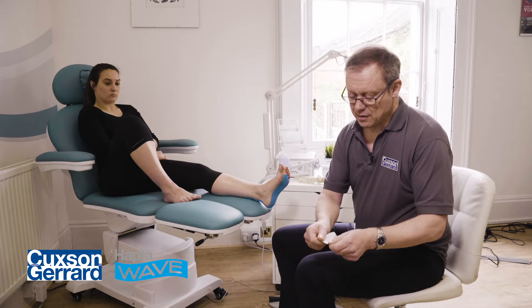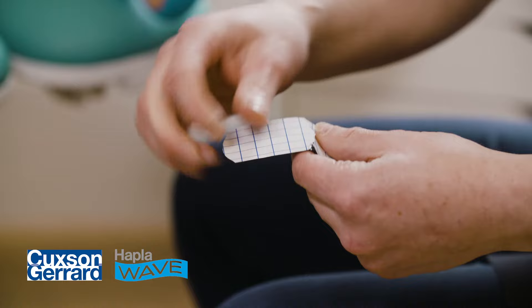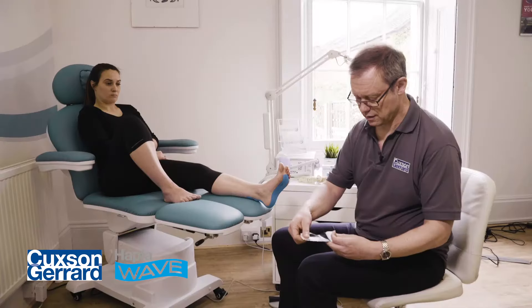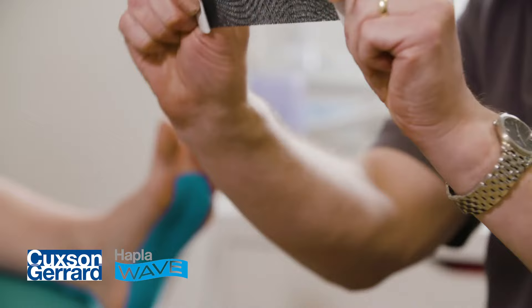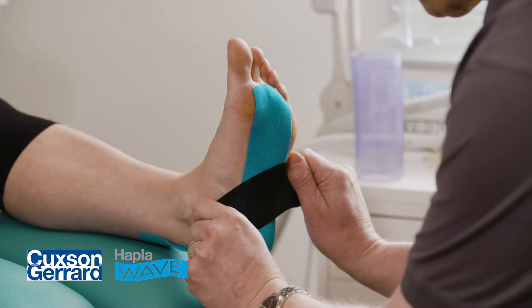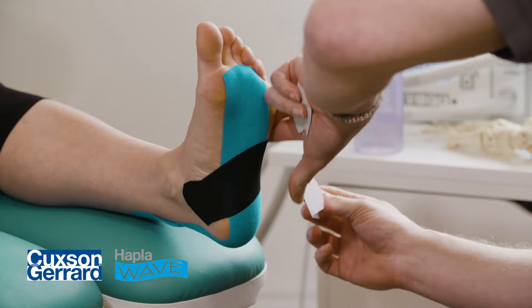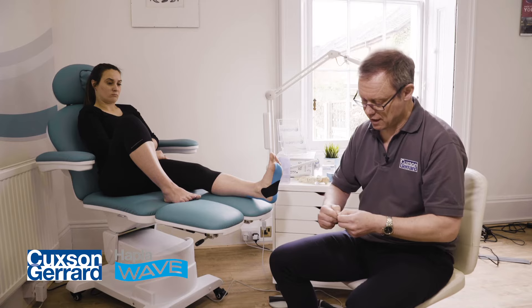We're now going to break the tape in the centre to establish two anchor points this time. Remember, the first piece had a single anchor point which we then applied the tape back to a final anchor point. This time we're going to establish two anchor points. There's the first — then we peel back the paper on the other side — there's the second. When I hold it, note that my thumbs are along the whole length of the paper, as are my fingers on the other side, so I can stretch it without curling it. There's 100%; again, we want about 50%, so that's halfway back. Dorsiflexing the foot, we're going to lay it across the tape at the point of discomfort. There's our medial anchor point — just roll that on. There's our lateral anchor point on the other side. There's our first cross piece.